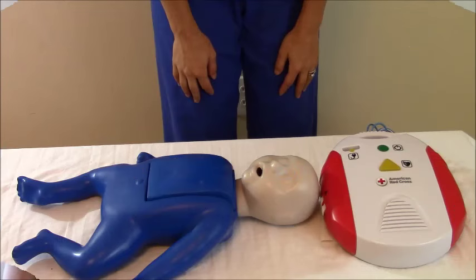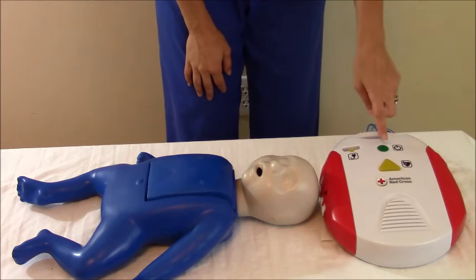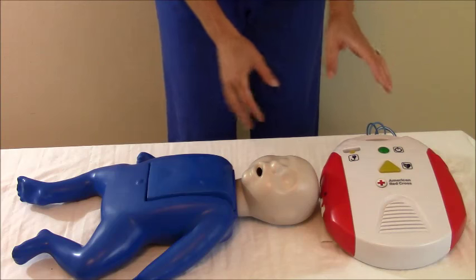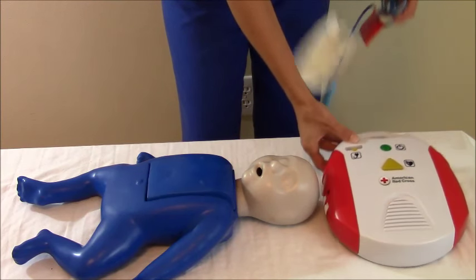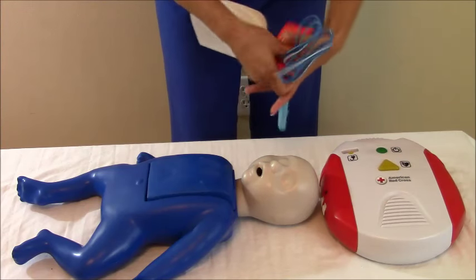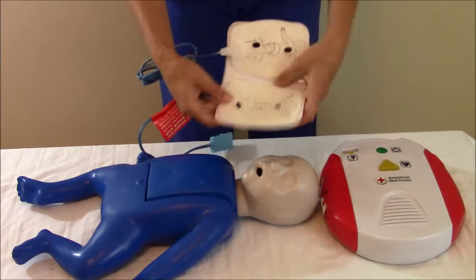Let me demonstrate how to place the pads and how to use the AED on an infant. Immediately whenever the AED arrives, you want to use it — turn it on. The very first thing you'll do is turn it on and it will tell you everything to do. You'll want to start getting your pads out. Remove clothing from the person's chest and expose their chest, and get out the pediatric pads if it has them.